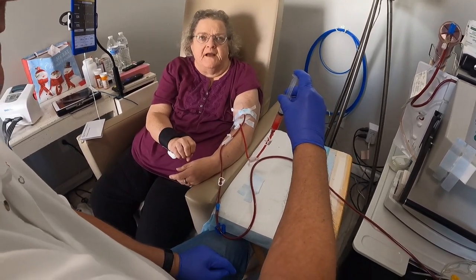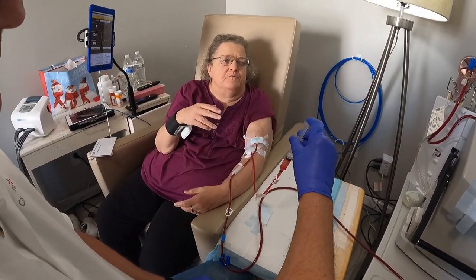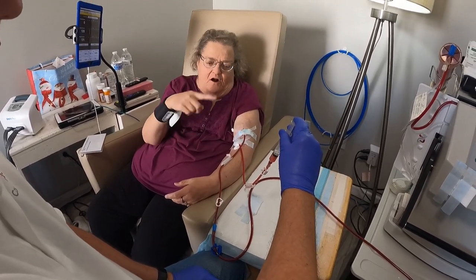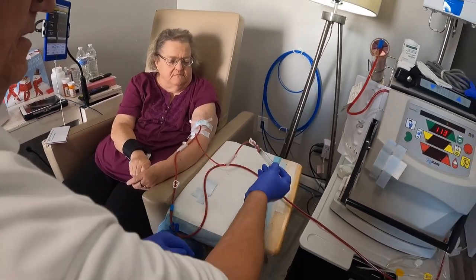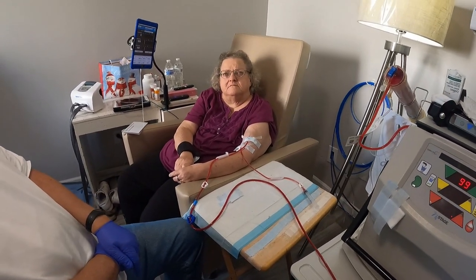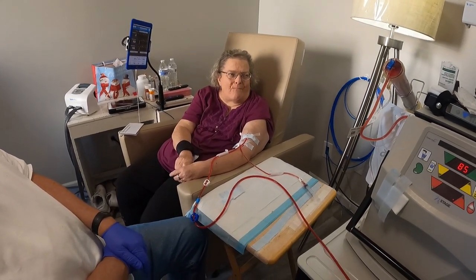When you do dialysis in center, the machine does all of that. But when you do it at home, it can't do all of it. So we have to actually manually clear this one. That's crazy. And then clip that. And I remember in the clinic, the popping in the motors and the pumps. You can see where they're spinning.